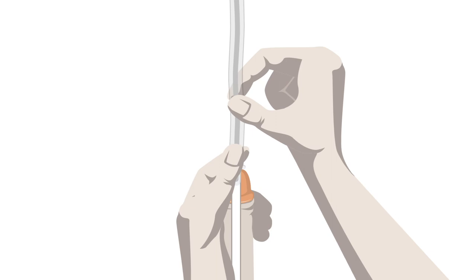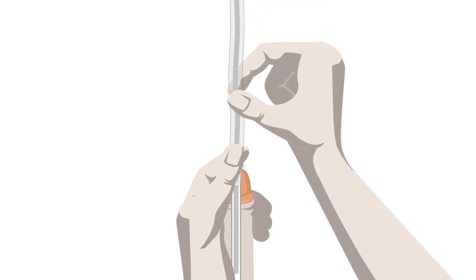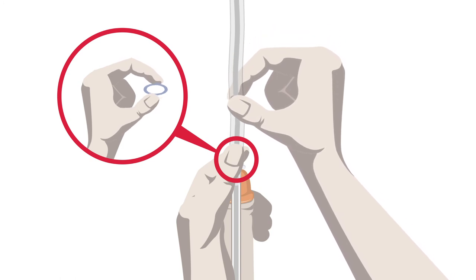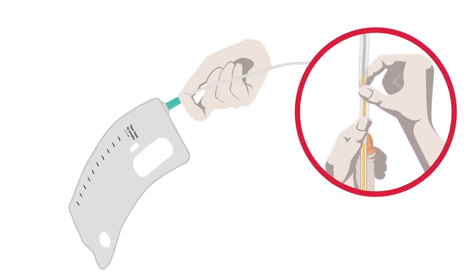Start to insert the catheter in short incremental pushes that allow the catheter to gently move up the urethra into the bladder. You can steady the catheter by putting pressure on the barrel whilst you move your hand to insert further. Continue inserting the catheter until urine starts to flow.